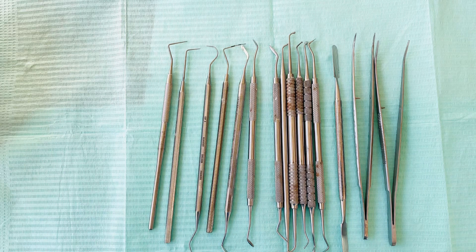Hi everyone, welcome back to my YouTube channel. Today we're going to learn the different dental hand instruments.